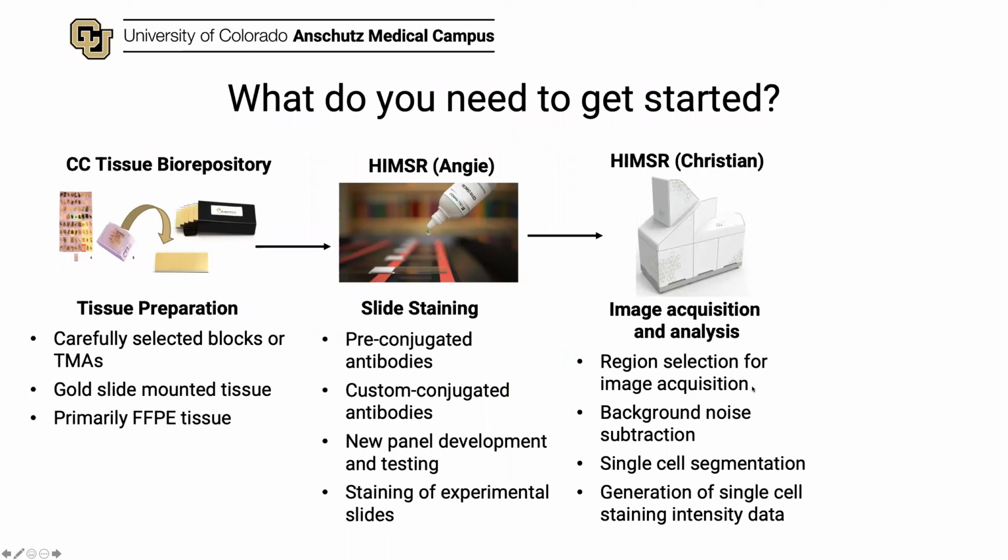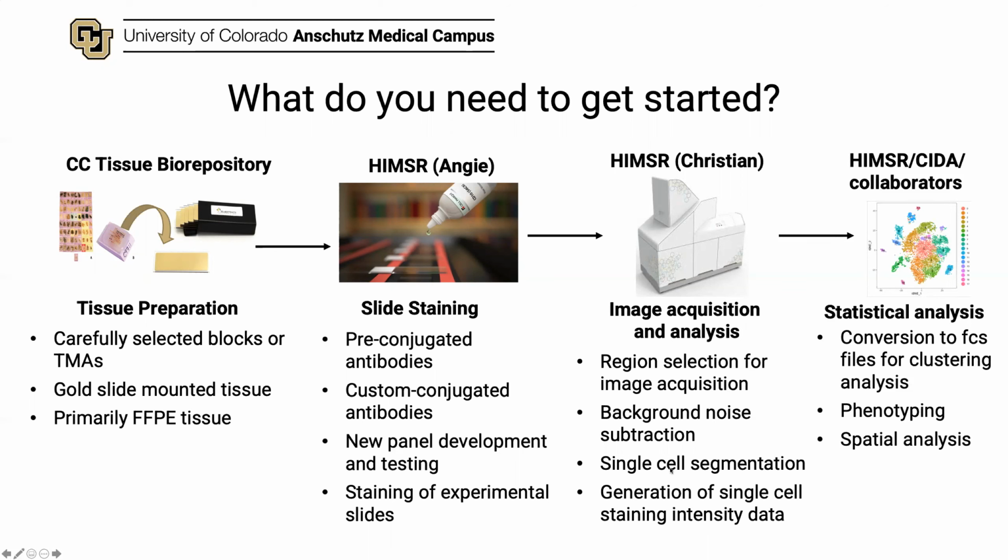After the images are acquired, he works on background noise subtraction, getting rid of the gold contamination, for example, and any instrument noise. He's also developed scripts for single cell segmentation and really getting you a single cell staining intensity data spreadsheet that can be used with any other workflow for analyzing those data. So he's both in the image acquisition and in the analysis side of things.